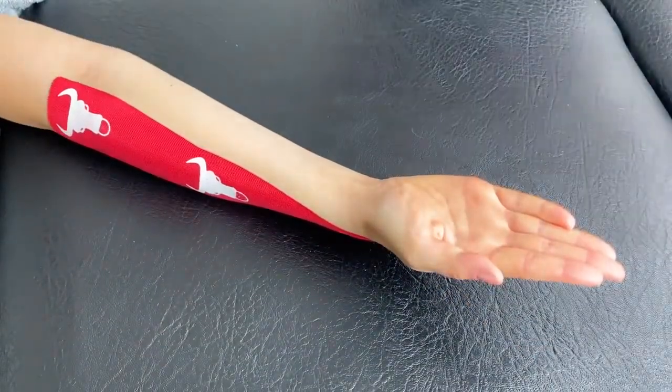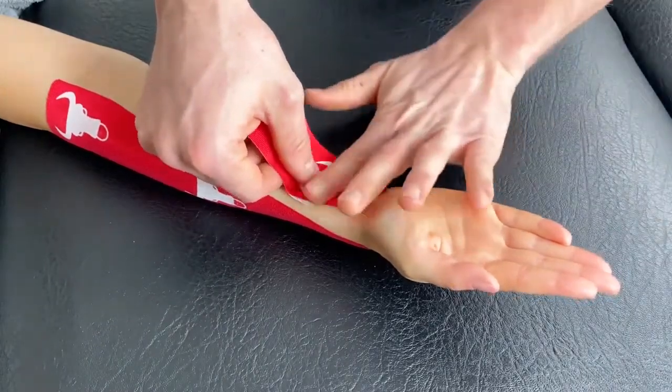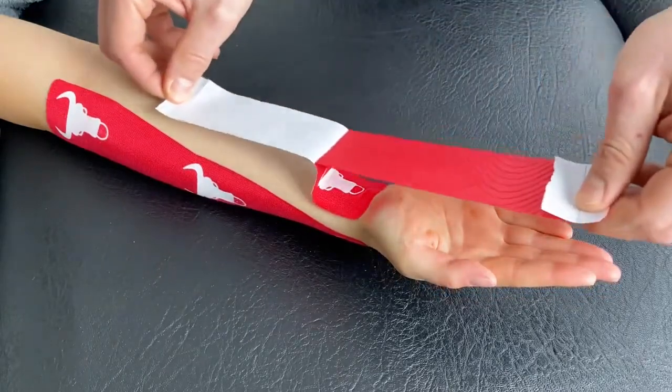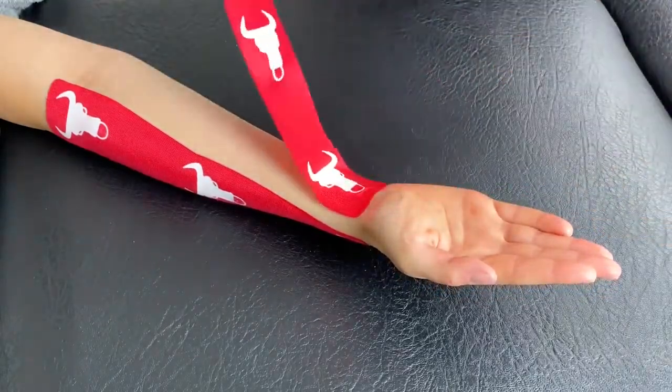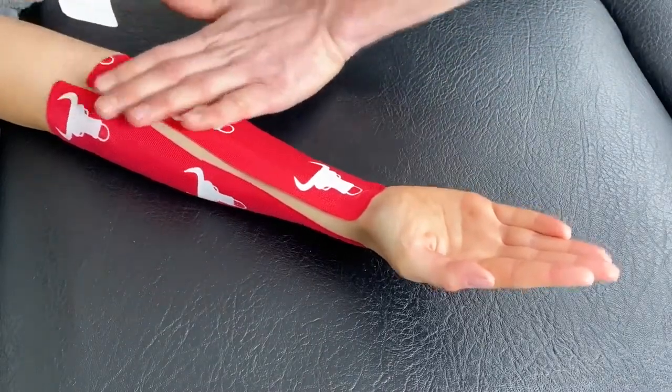The second piece will then be applied just above the wrist joint and applied toward the medial aspect of the elbow with no tension, ensuring the tape stops at the end.